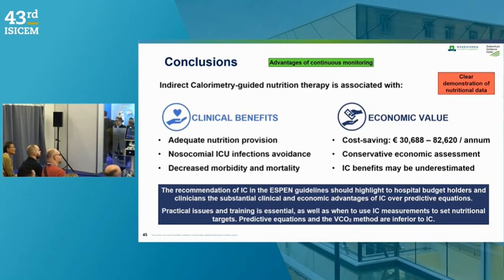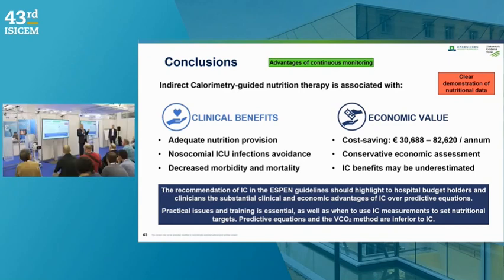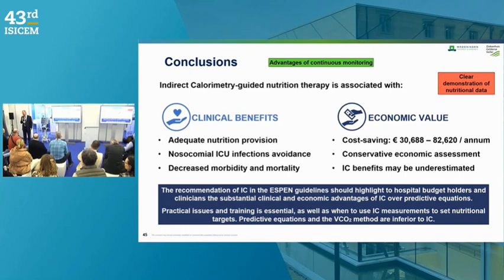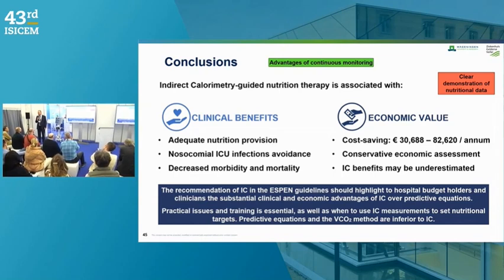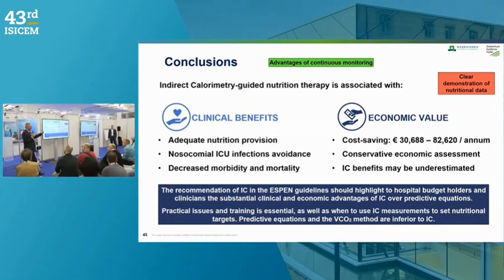So we give it, but we will measure frequently to be sure that maybe not 2 days later it's like 2,500 and that we are overfeeding 500 kcals in this patient. But I think it can be rather safe to give this high energy expenditures. And during COVID, we've seen very high values during the recovery in the second week, sometimes 3,500 kcals in patients. And when you use an equation predicting 2,000, you're having a deficit of 1,500 kcals. So that's interesting. More questions, please.